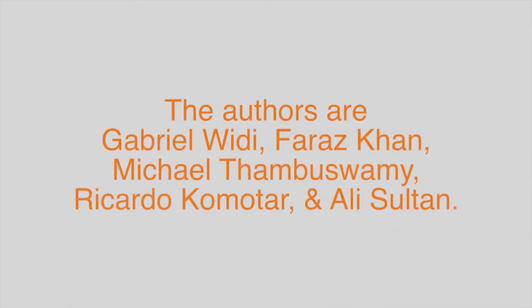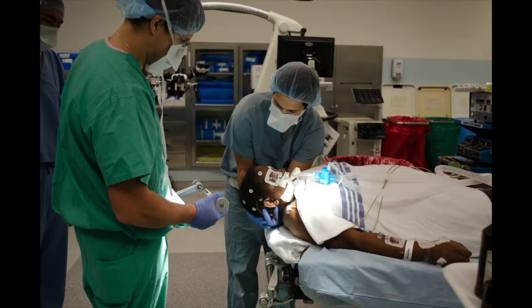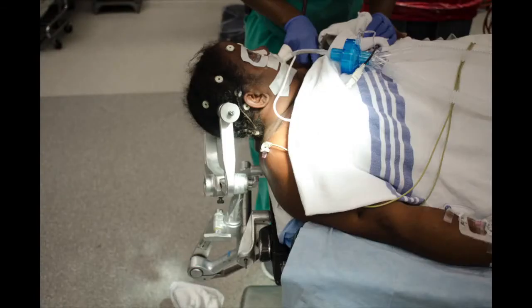This video is a narrative of a bicoronal resection for a meningioma. The patient is positioned supine with their head neutral and elevated. Cranial fixation is obtained via a Mayfield clamp with the pins placed vertically and as posterior as possible in the temporoparietal region bilaterally. Perioperative antibiotics are administered.